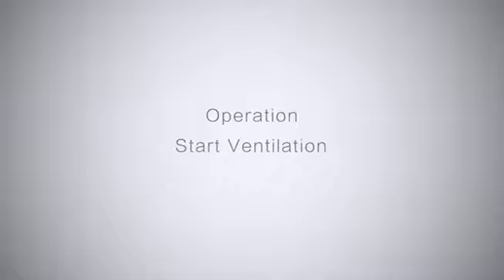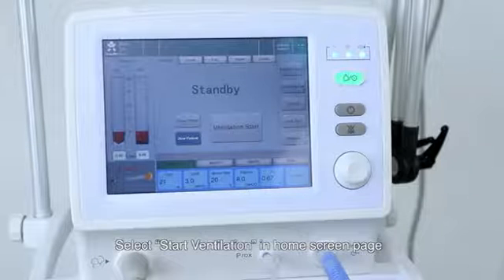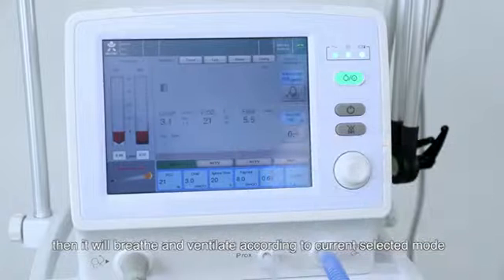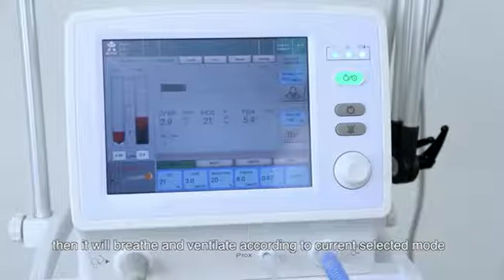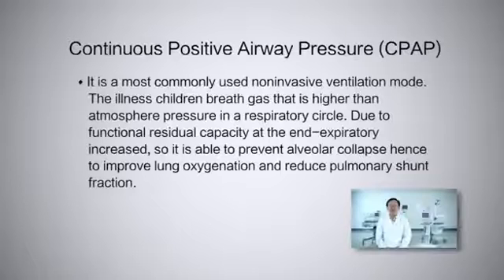Operation. Start ventilation. Select Start Ventilation in home screen page. Then it will breathe and ventilate according to current selected mode. NCPAP mode selection and operation.